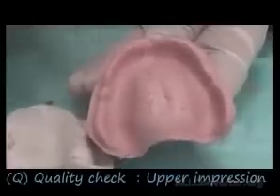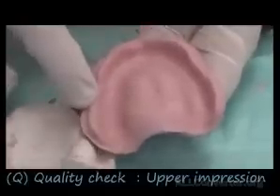Notice that the impression should be checked for quality. What is the quality we check for impressions? We're checking to have a continuous roll of material in the sulci.